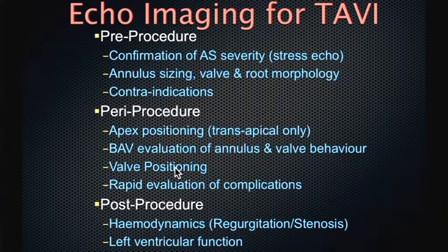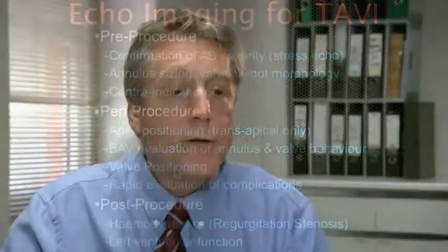And then finally, assessment of left ventricular function, and hopefully seeing some improvement in LV function in patients who have impaired LV function prior to procedure, is usually best assessed with echocardiography. So both pre-procedure, peri-procedure, and in follow-up, echocardiography has an important role to play. And through various aspects of this DVD, hopefully we've highlighted how that can be done best and how you can use echo in combination and to complement the other imaging modalities that are available to us.